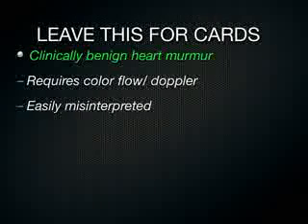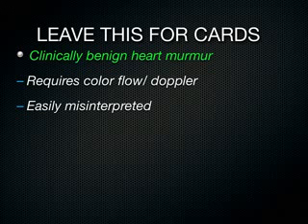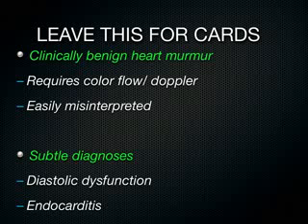But stuff we're going to leave to cardiologists: stuff with a heart murmur. You come out of the room and go, hey, the patient's got a heart murmur, want to go look at it? Yeah, I'm sort of curious, as any doctor would be, to look at the heart and see what the murmur looks like. But really, to differentiate how much TR, MR, 1+, 2+, those things have no clinical bearing for me as an emergency physician, and it's easy to misinterpret those kinds of color flows across the valves. So other things like early diastolic dysfunction, endocarditis, I've hallucinated hundreds of times now. Just stay away from that stuff unless it's super obvious.